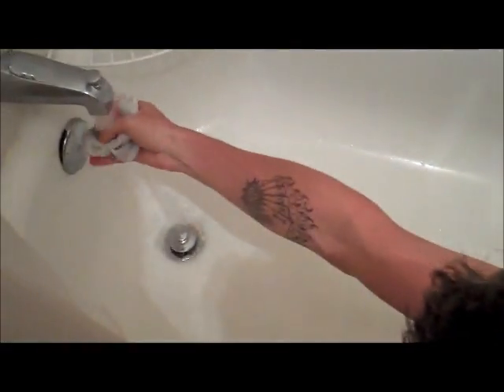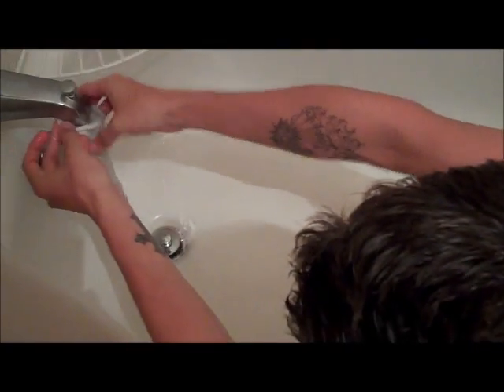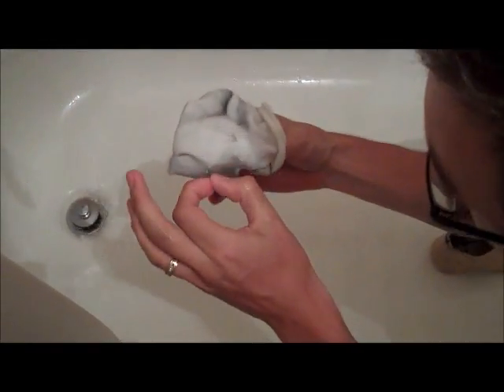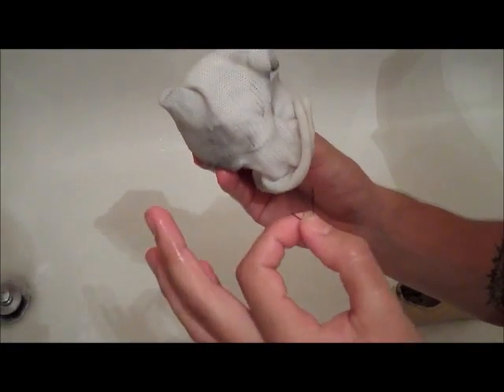Then you just get a clean Spectra sock. Try to get it on the inside too. It's not the most comfortable.